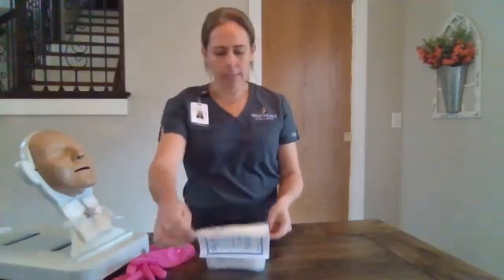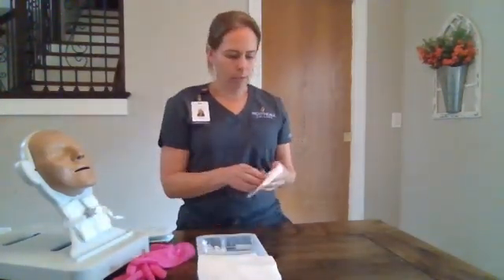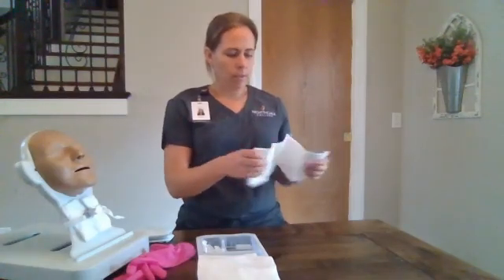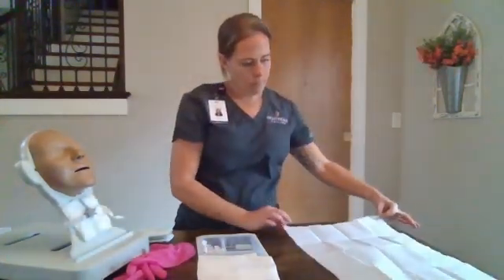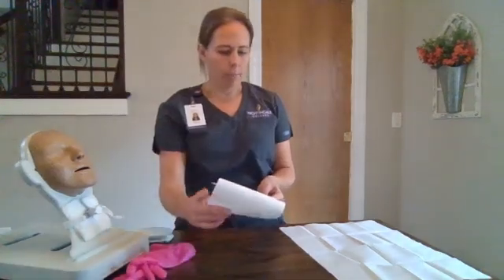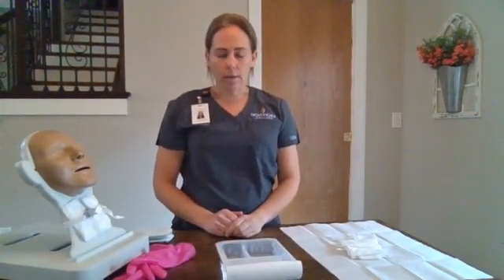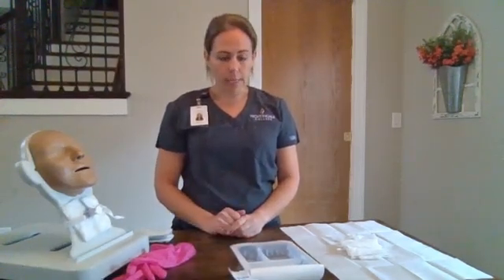We'll set up our supplies, pull our gloves out, and we will set up our sterile field. We'll empty our supplies onto our field, fill each of the three sections of our container with sterile normal saline, and in one of the sections we can put a one-to-one peroxide solution as well.